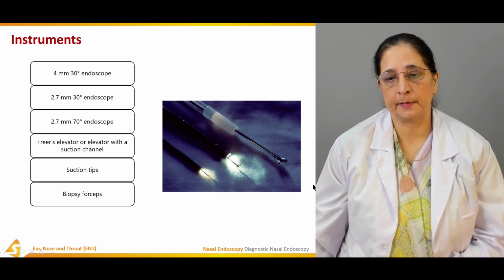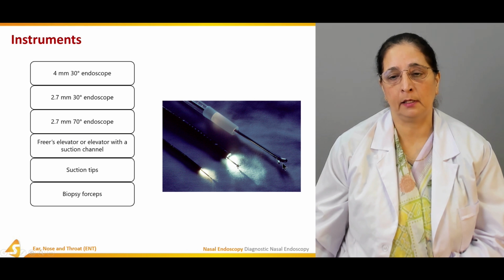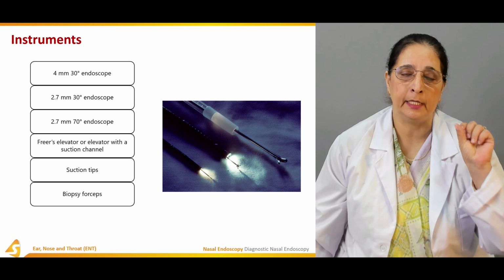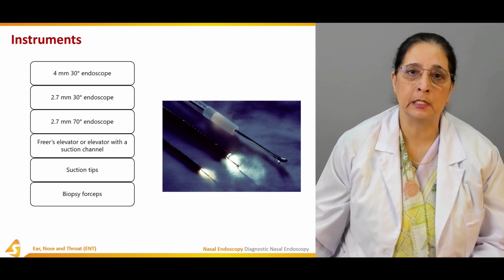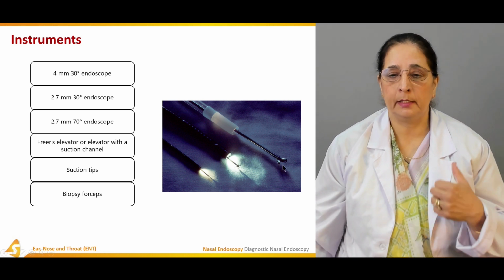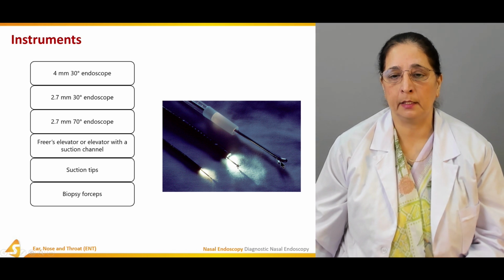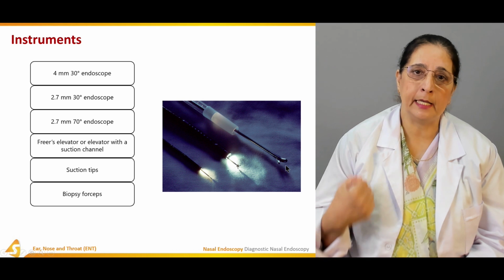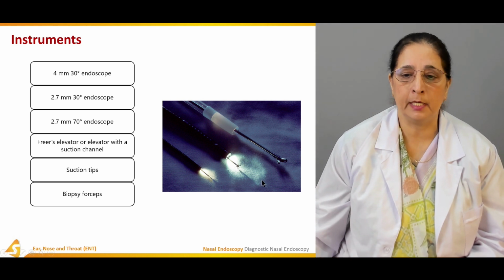Biopsy forceps enter, and on the mass or the area from where tissue is to be removed, you close it and the tissue is removed for the biopsy.